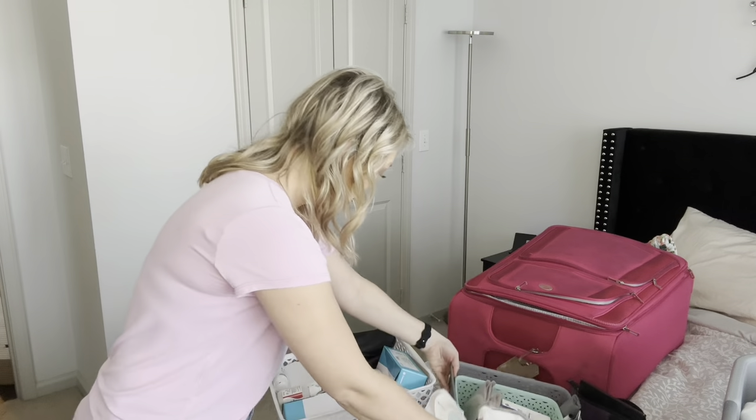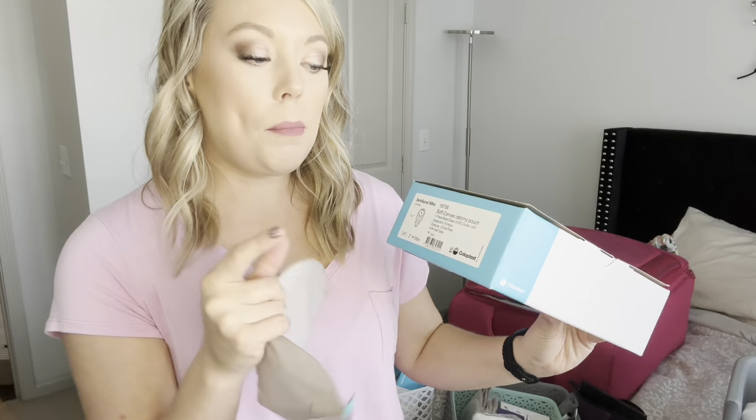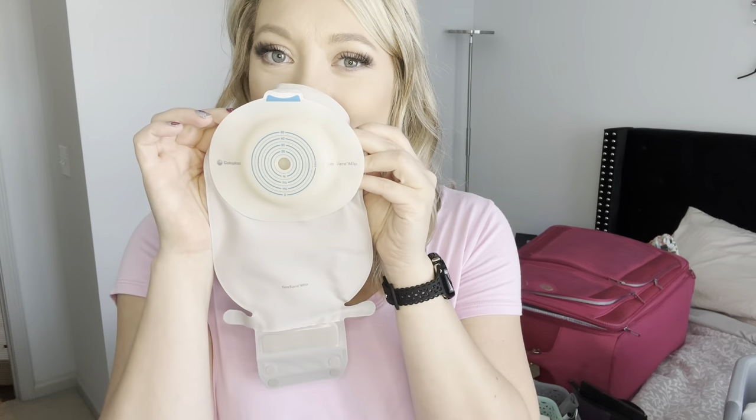I always keep the original box to make sure I'm ordering the same kind of bags. I wear the 16706. This is a one-piece bag, which means your flange and bag are all connected — all you have to do is cut out the size of your stoma and slap it on. Easy peasy — that's why I like the one-piece bags.